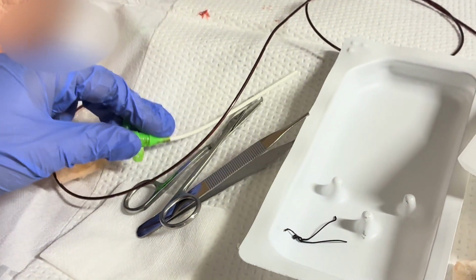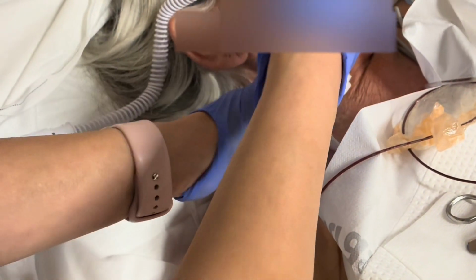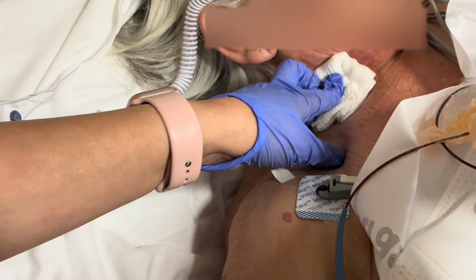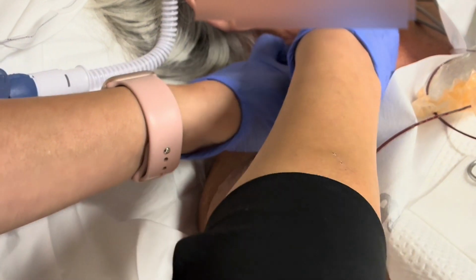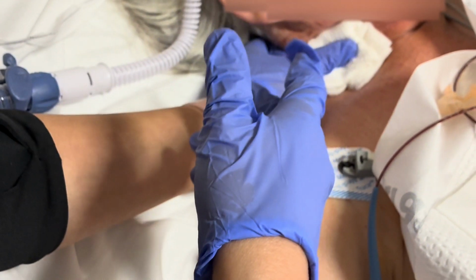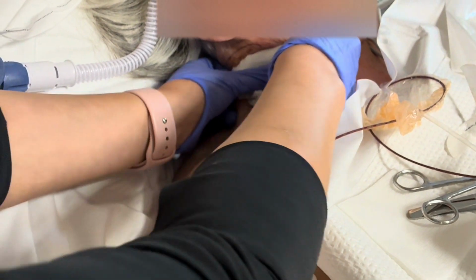And now, since the catheter is already out, we could have the patient sit up a little bit, and that would help also with bleeding. I don't think she's bleeding, but you want to make sure that you put pressure in here. Again, this is a venous catheter, right? Because it's going to your IJ. It's not arterial, but still. If it's arterial, then usually we put pressure for like 20 minutes. This one, 5 to 10 minutes should be okay.